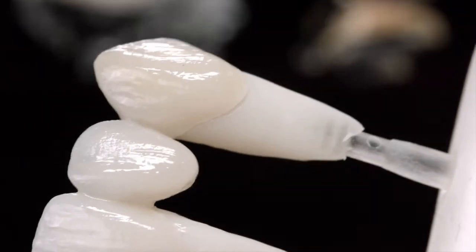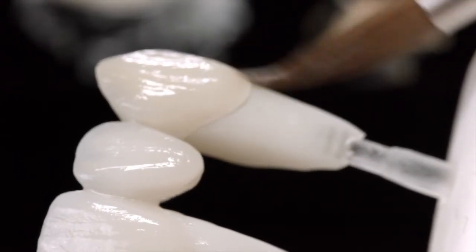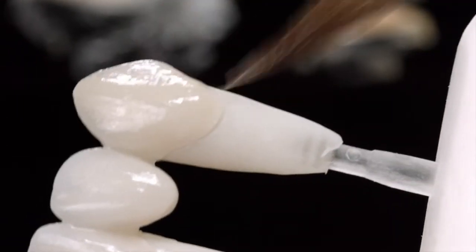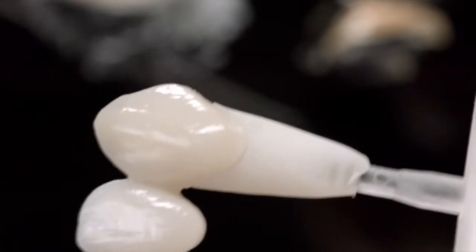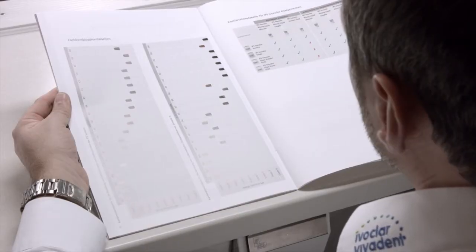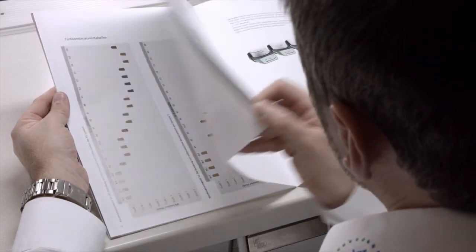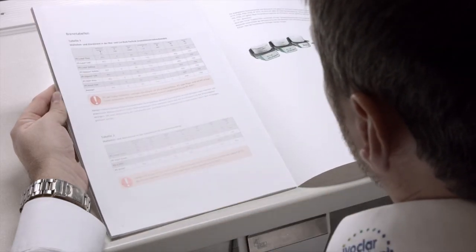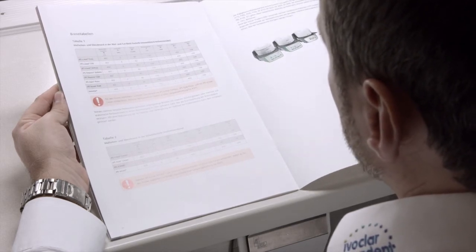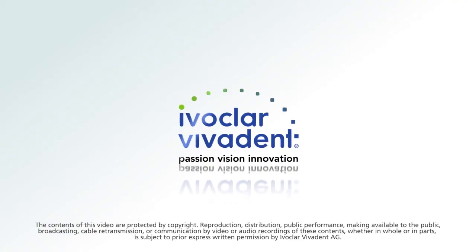The great advantage of IPS Ivocolor is the low firing temperature. This allows you to glaze restorations with monolithic and veneered parts in a single bake. IPS Ivocolor is suitable for all IPS ceramics, with the exception of uncrystallized IPS e.max CAD and IPS e.max CAD-on restorations. During processing, please observe the safety instructions and production details stated in the instructions for use.